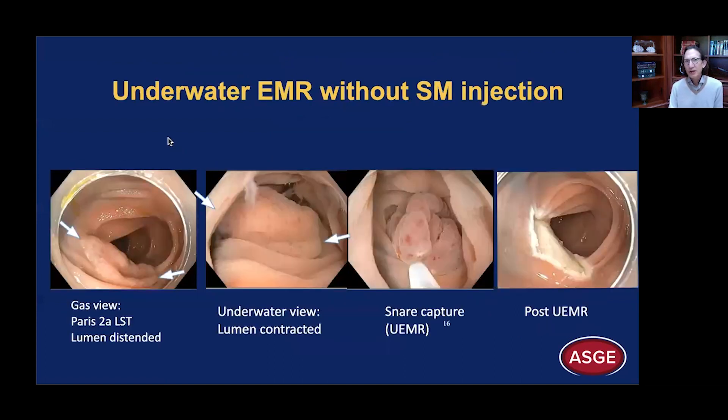This led to the development of the UEMR method. In the gas view, another example appears Paris 2a — very flat, with the lumen quite distended with gas. After infusing water and water submersion, we get the underwater view: the lumen contracts and it's raised. So now we can easily lasso this raised lesion as if we had injected submucosally, and perform en bloc resection. With one ensnarement, you can see the appearance afterwards — this is the lesion that was growing along a fold.